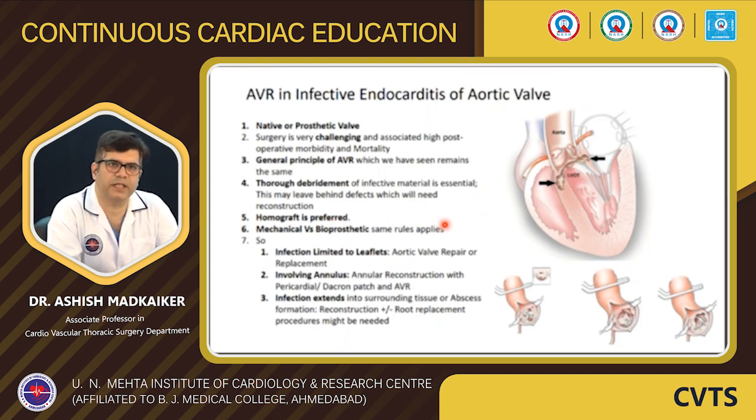So centers with experience in homografts have shown good results. When it comes to choice of mechanical and bioprosthetic, the same rules as choosing this prosthesis in general situations apply, as there is no superiority of one over other. So if we see, usually we may be encountering one of these three situations.